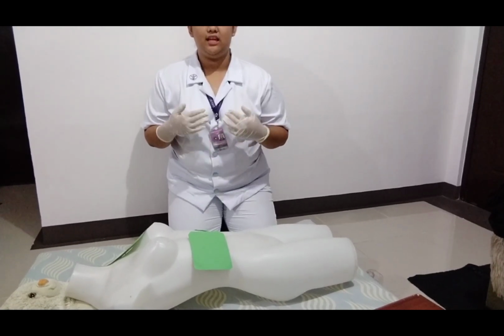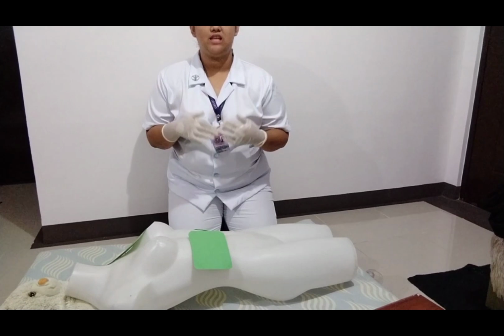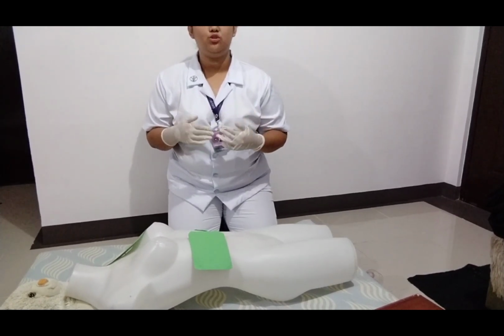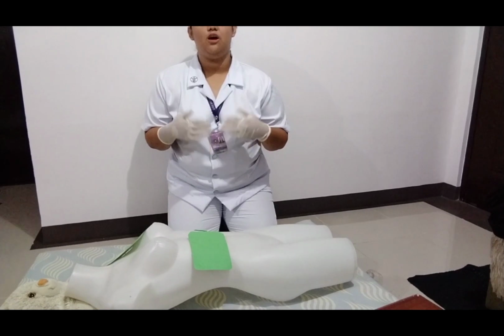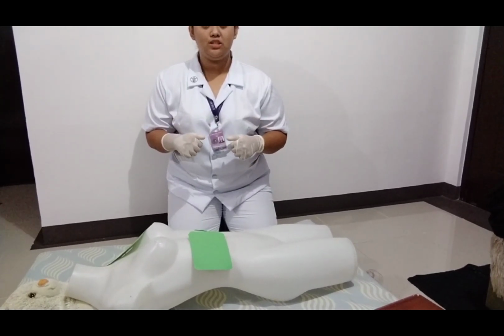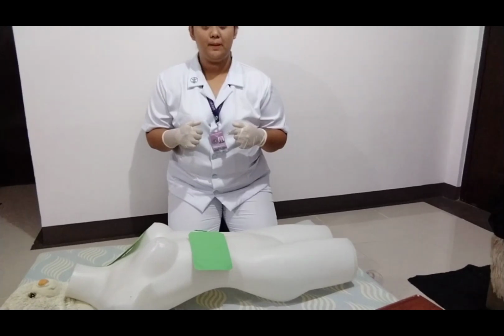for how many cycles, and then after that, it will reanalyze the patient's heart rhythm. And if necessary still, it will deliver an electric shock. So we'll continue doing that until the AED tells us to stop, or until the patient has already revived. So after doing all the procedure, we have to document the procedure done, from the time the resuscitation started until the time it ended.